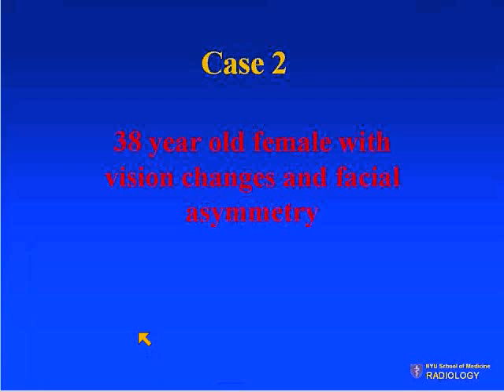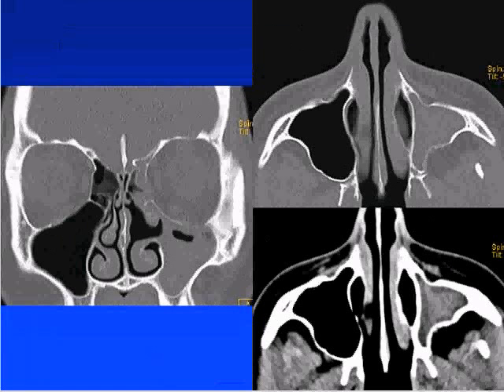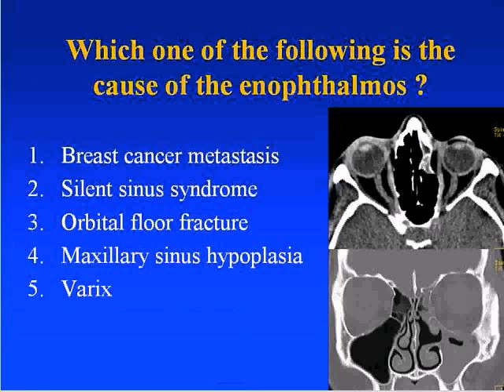The second case is a 38-year-old female with vision changes and facial asymmetry. Here is a CT through the orbital region, with additional images in both bone windows and soft tissue windows through the facial region. Which of the following is the cause of this patient's enophthalmos? Number one, breast cancer metastasis; number two, silent sinus syndrome; number three, orbital floor fracture; number four, maxillary sinus hypoplasia; or number five, orbital varices.